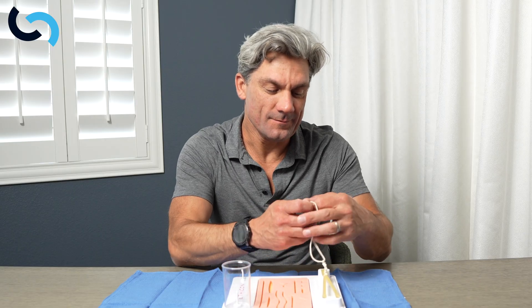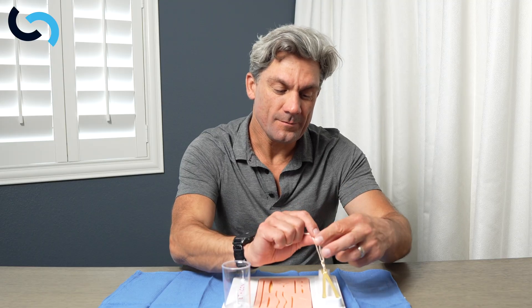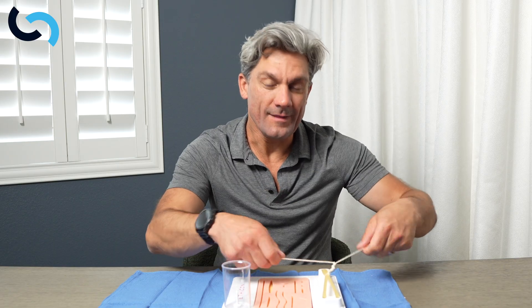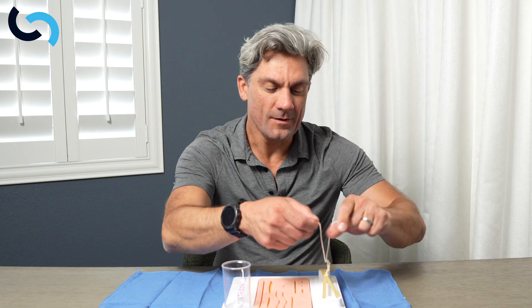The two-handed knot also showed you the surgeon's knot. The surgeon's knot — I'm starting to get short on string here — but it's just two throws. Get that knot down square, and then follow that up with single throws, making sure that we're not pulling up on the tissue.